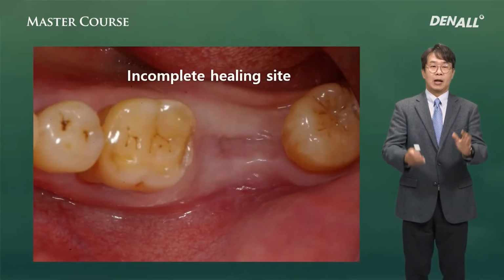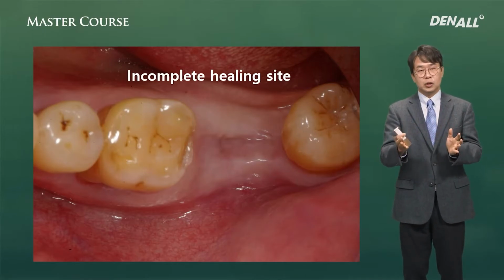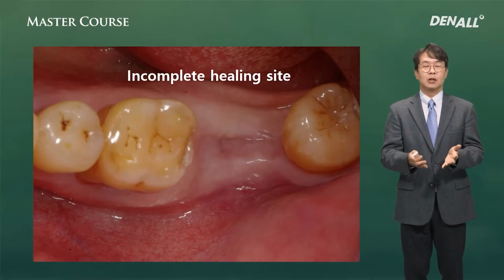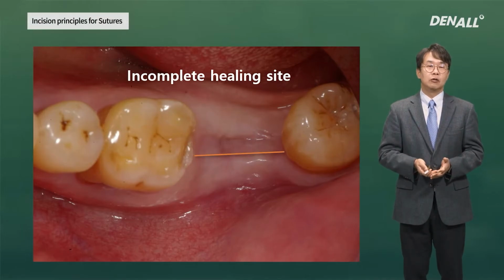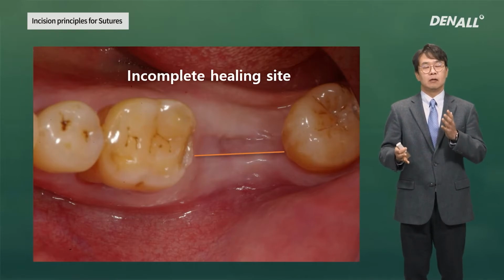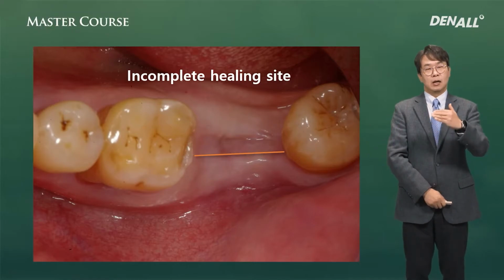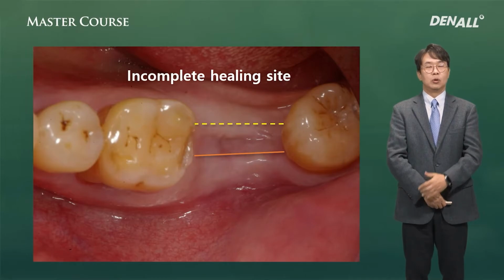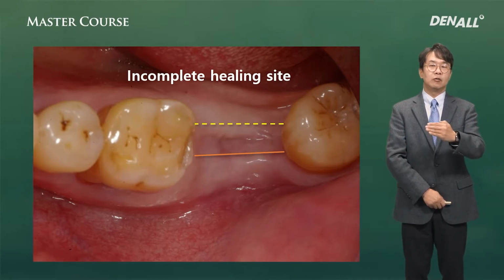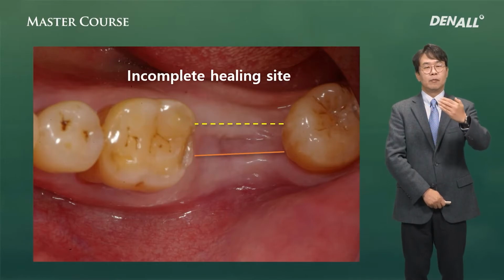After extraction, the soft tissue is not completely healed. So in this area, if you make an incision here, tearing can occur. So you need to position the incision lingually over the healed area.